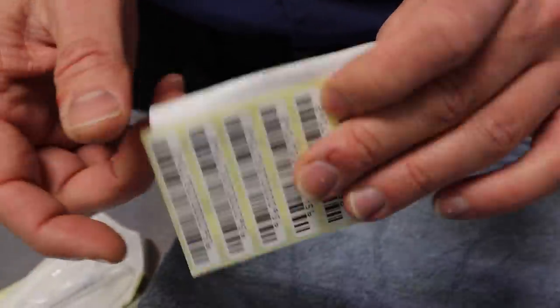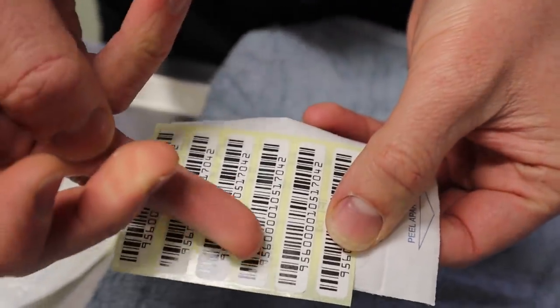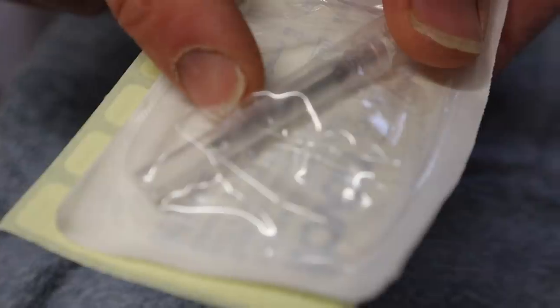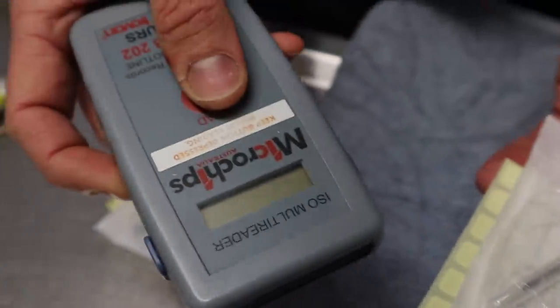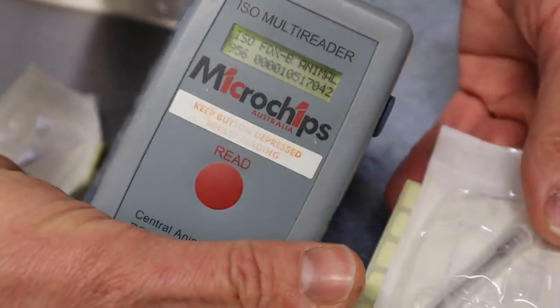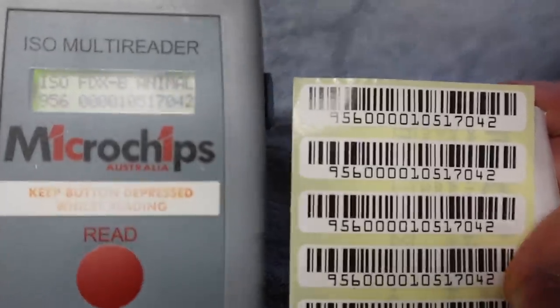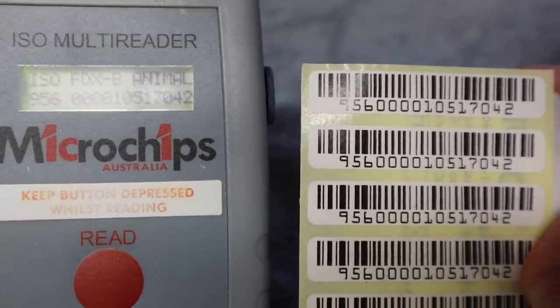This here is the microchip that we use in Australia. It's an ISO microchip, so there are 15 numbers on the microchip. They come in a small needle like this — the microchip will be at the end of the needle inside the package. We use this scanner to get the number, and it beeps and displays the number. Those two numbers should match. This number then goes on a database which is connected to the client's name and their address.